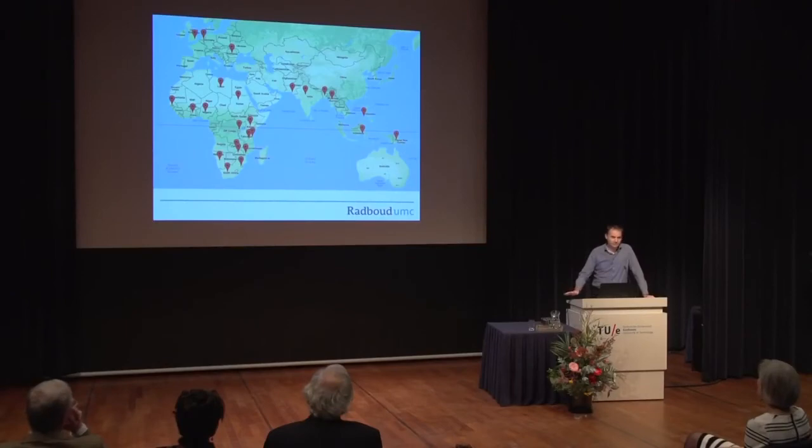And there are a few really big screening programs that are using a lot of these boxes because that's the only way they can screen a very large number of people. If you have to have human-trained readers on site next to the X-ray machine, that's just logistically very hard to achieve. And now you don't need that. You just need somebody to operate the machine. And within a minute, you will know whether this person has to give up sputum or not. So then with limited sputum capacity and one X-ray machine, you can screen very large amounts of people.